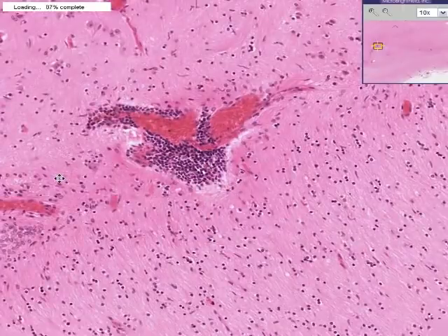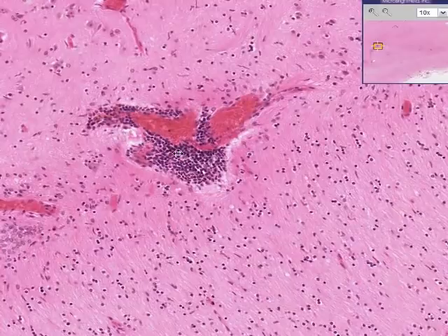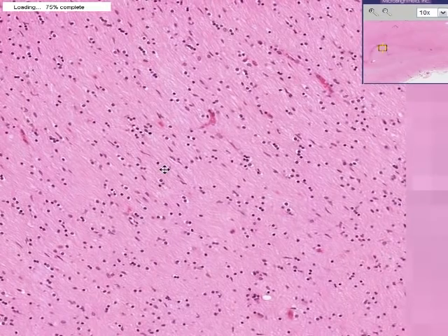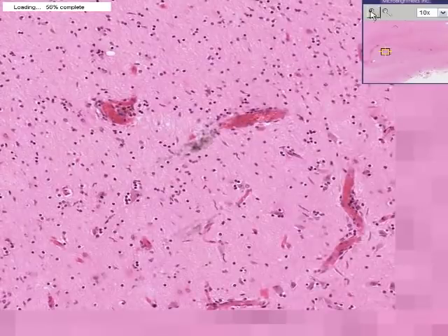There is a potential, or at least theoretical, space surrounding the intracerebral blood vessels called the Virchow, as in Rudy Virchow, Robbins, as in Stanley Robbins, space. And the Virchow-Robbins space in encephalitis becomes engorged with lymphocytes. But you'll also note that in the areas of the brain in which you do not see too many prominent vessels, there may be an increase of glial and inflammatory lymphocytic cells there as well.